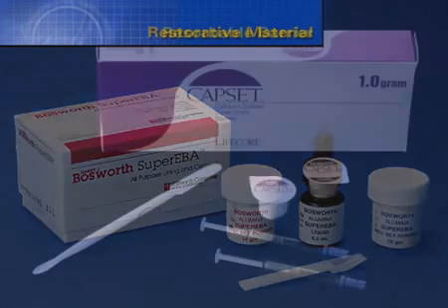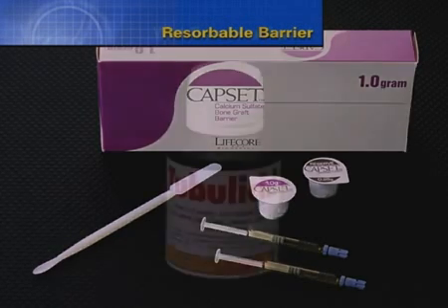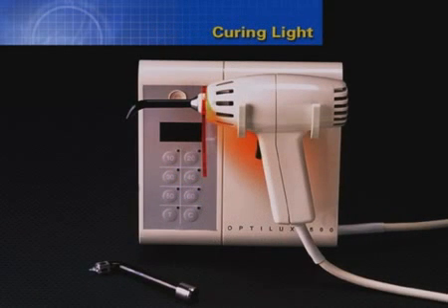Like Collacote, CapSet is another biocompatible, resorbable material that promotes hemostasis. CapSet is the barrier of choice when utilizing the principles of wet bonding. Importantly, the perforation defect and the barrier can be rinsed of contaminants and prepared for adhesion dentistry. Tubulicid Red contains EDTA and releases fluoride and is an excellent wet bonding agent to clean the preparation and improve the restoration to dentin seal. A Focu-tip attached to the wand of a curing light serves to collimate light into restrictive areas and facilitates bonding procedures.